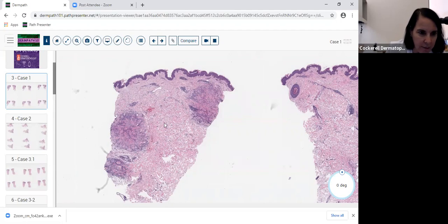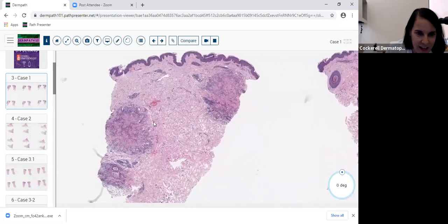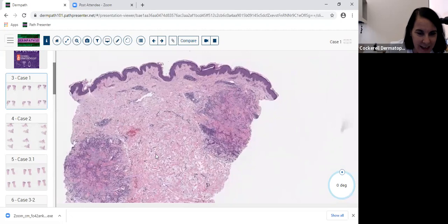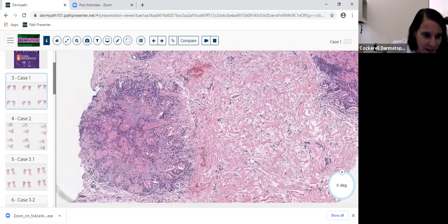You're seeing activity. Some of you who are further along may have already guessed what this is and have on low power immediately jumped in on the answer, but we're going to go through this step by step for the first years. Right away, you're noticing these areas of activity, and you're noticing they're circular areas, and that kind of goes along with the annular configuration clinically.